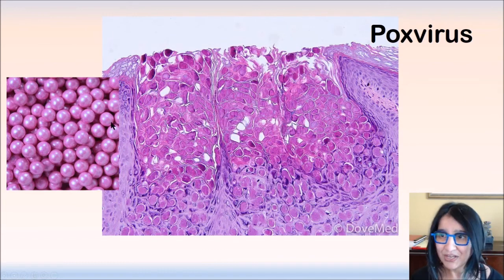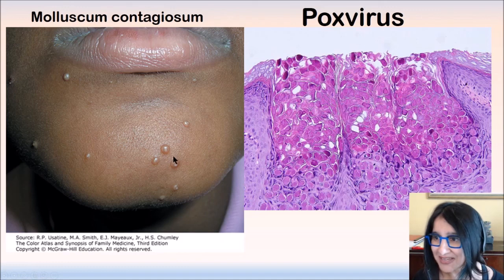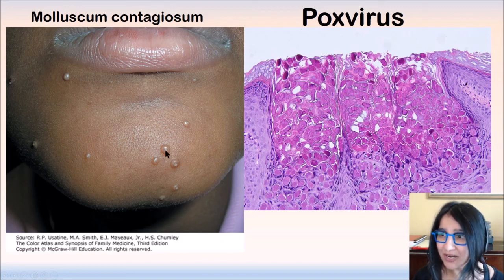Pox virus. So take a look at this image. I kind of like this image. This is actually one of the prettiest things under glass. This is something called molluscum contagiosum. What you see clinically are these skin breakouts. It might be prettier under glass, I guess, but these raised, they call them pearly lesions. You can kind of see that, very shiny. And in the center, you have a little pale area, and that corresponds to the cup shaped area that is holding all these viral inclusions.